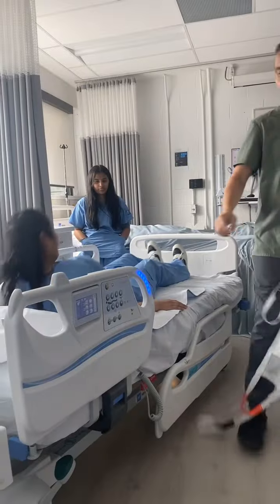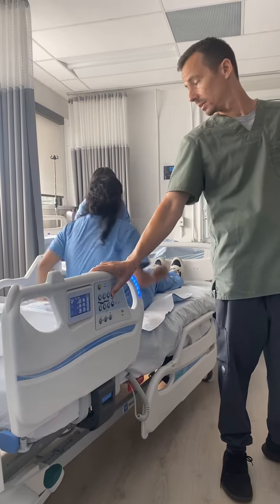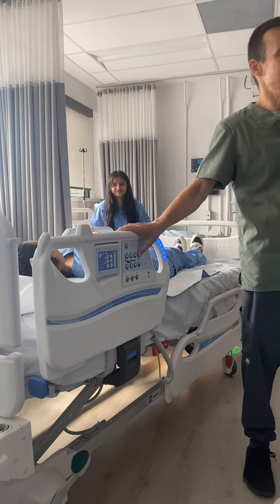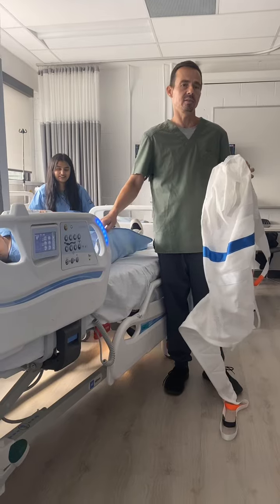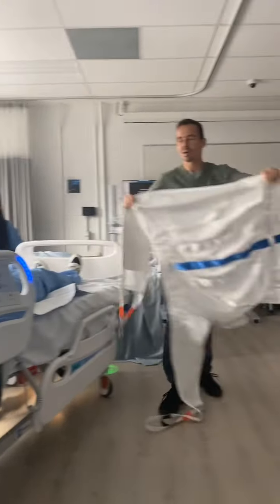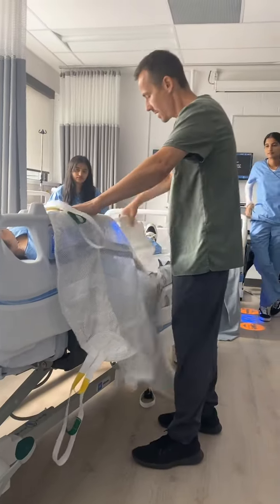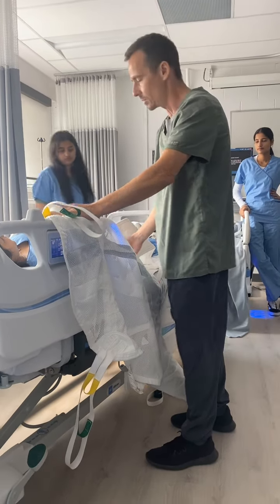Whatever. So first step, you want to get the patient ready, right? You need to put the sling underneath the patient. That's basically the same steps that we use when we change the square pad or the bed sheet or whatever it is. So you want to align that the head is in the head portion and that the lower part is at least at hip height, right?